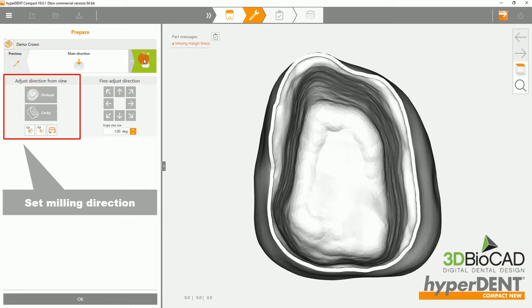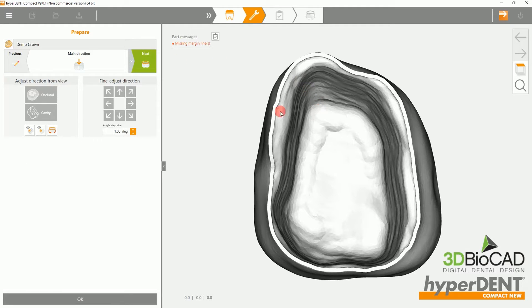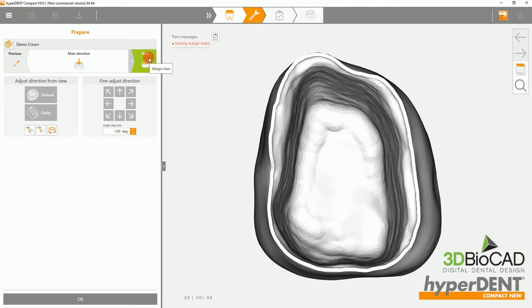Next, you can set the milling direction. Please select Cavity and move on to the margin lines.